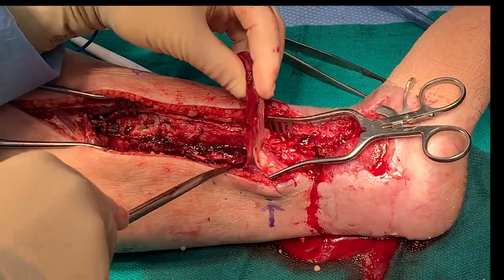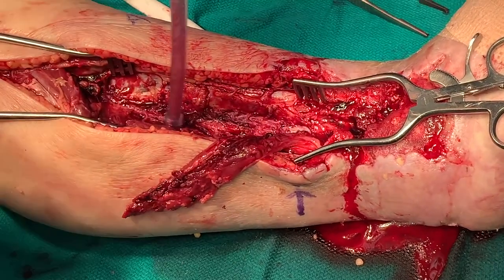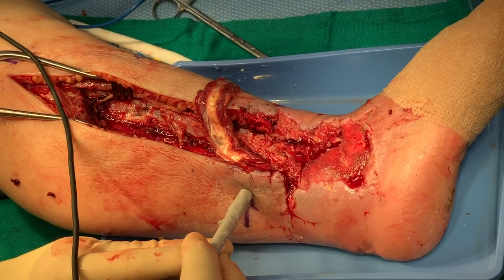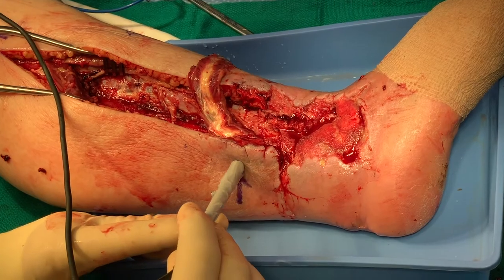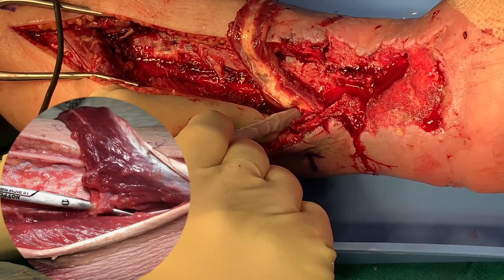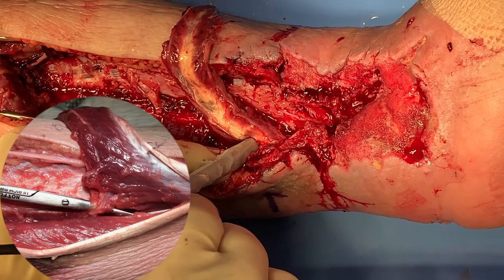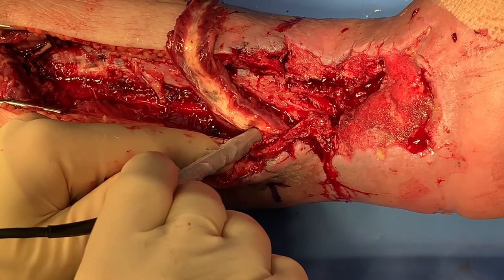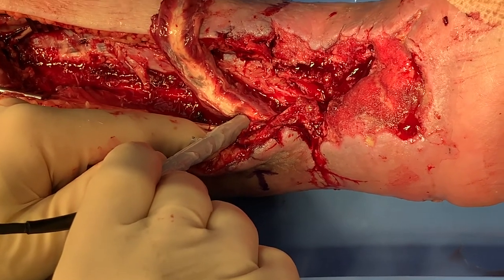In most cases, only the most distal one or two perforators are preserved to allow enough mobilization of the muscle to reach defects around the foot and ankle, especially the medial side of the ankle. Once we reach the desired length of the flap, we check and confirm that the remaining vascular pedicle is intact and patent using the Doppler. Careful exposure of the consistent distal perforator can be done to visualize it, but at some risk of injuring it and its supporting structures and tissue. Simple Doppler confirmation is all that is necessary to confirm a patent perforator.